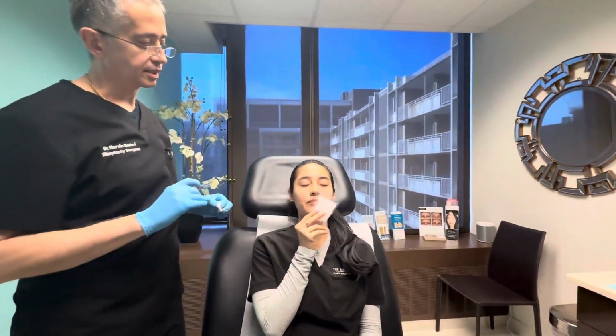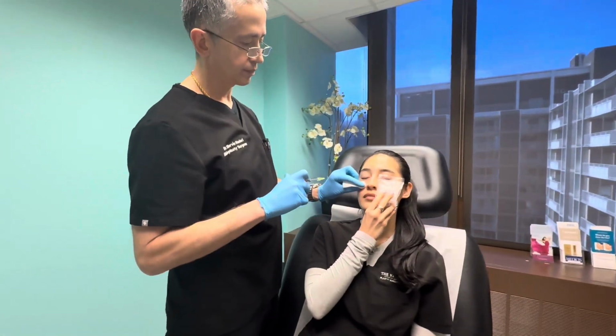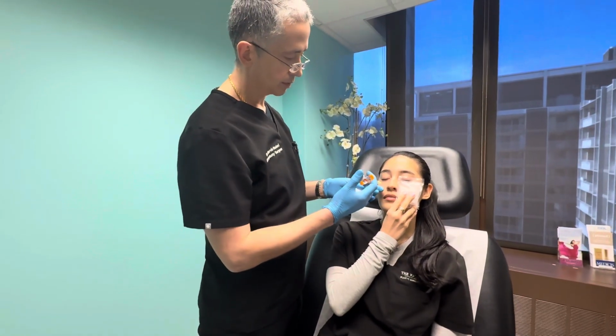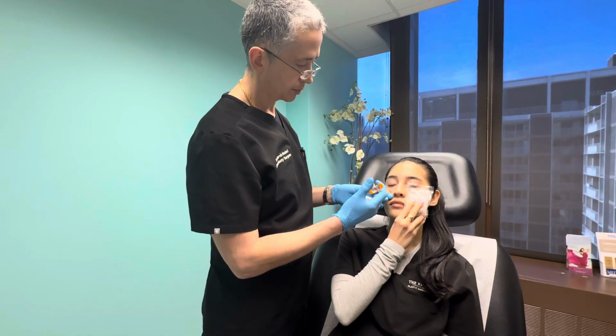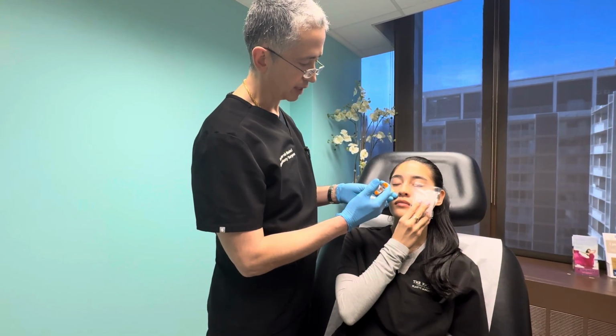You can put the ice on the other side. Right. Just gentle on it. Cool. Finishing up. Go back here. Building up the shelf again, straight down.